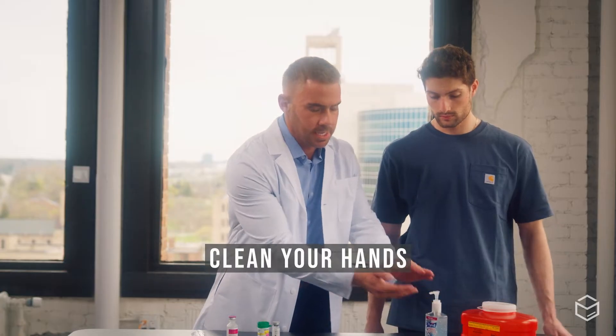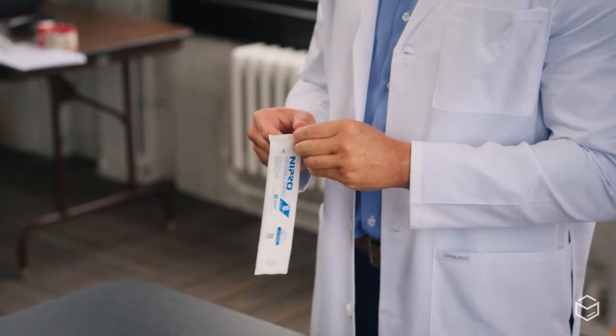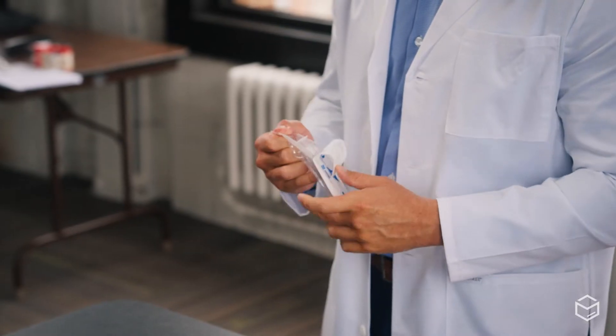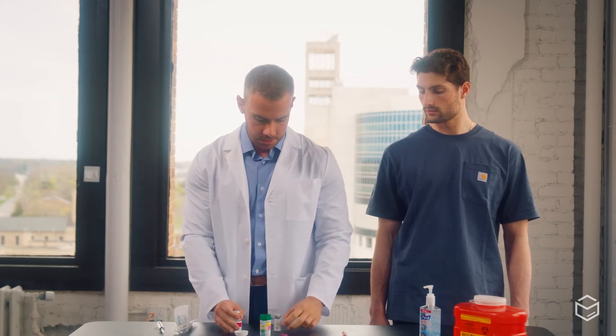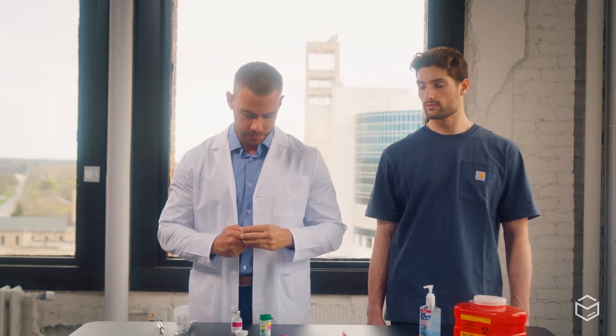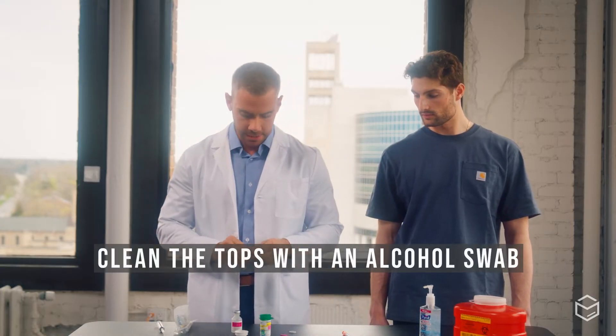To begin the reconstitution process, first start by cleaning your hands — today we're using hand sanitizer. Take your large gauge needle out of the package and set it aside. Then take the tops off of both your bacteriostatic water and your medication, and using an alcohol swab, clean both of them.